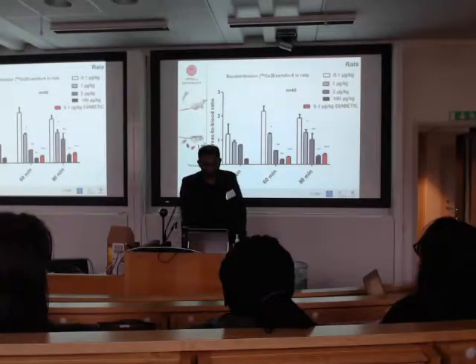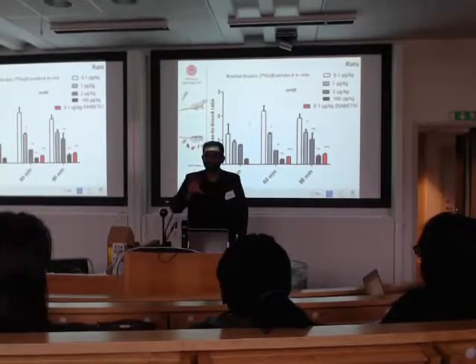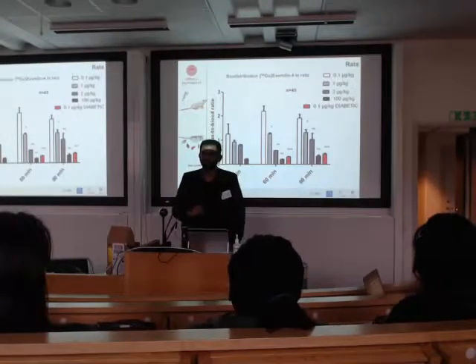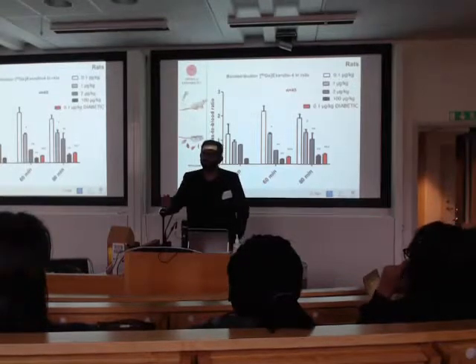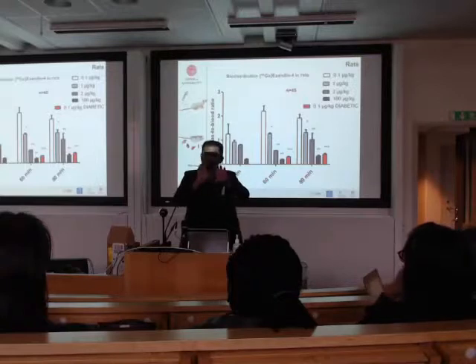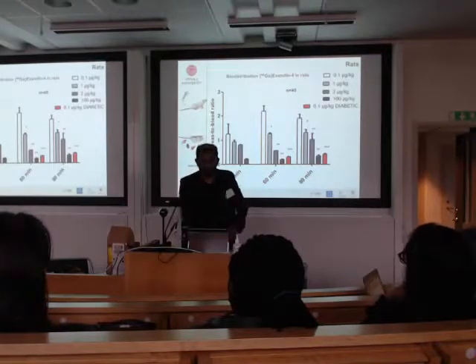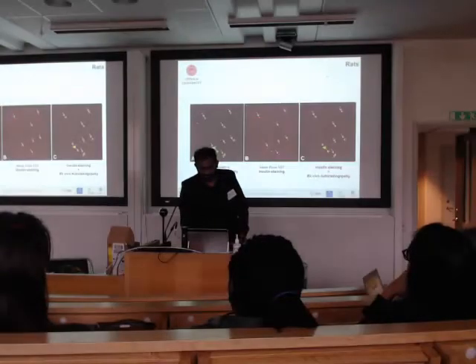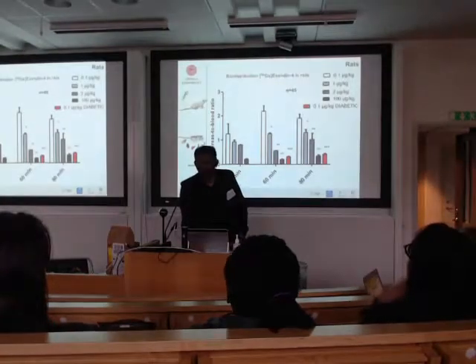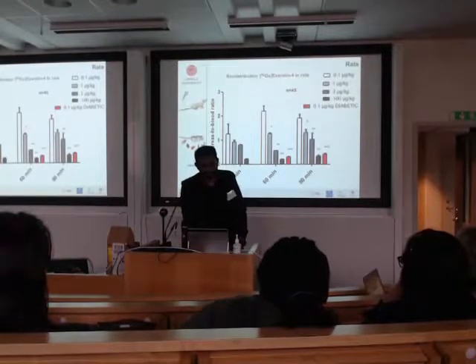We escalated it. Here we did something called a dose escalation study. So you have a baseline, say 100 units of your tracer. In the dose escalation study, you have 100 units, and you increase by adding 200 units of unlabeled peptide. What you're doing is a competition study. So upon increasing the cold peptide, you increase the competition and you could see the uptake in the pancreas decreasing.